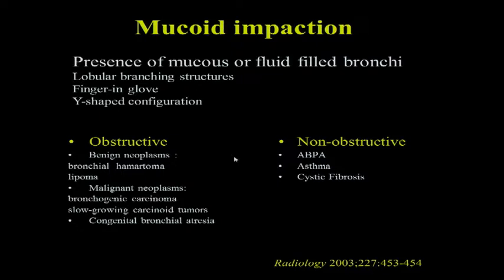You see a blind-ending bronchus, like near the mediastinum. It looks like a solid... That's one half. The second half of the... You've said one half correct. There are two things, and you see something else, and you put the two together. Hyperlucency of those sites. Very good.